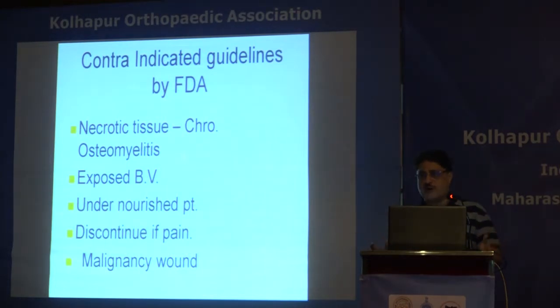If there is more necrotic tissue, then the skin becomes more of a problem. Exposed blood vessels, undernourished patients, and macerated skin can also cause problems. Malignant wounds are contraindicated for VAC.